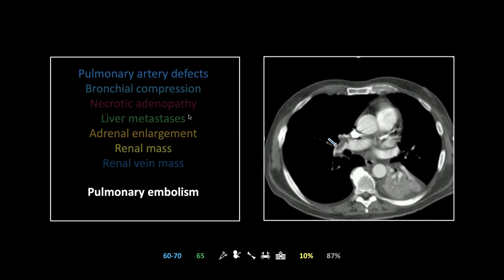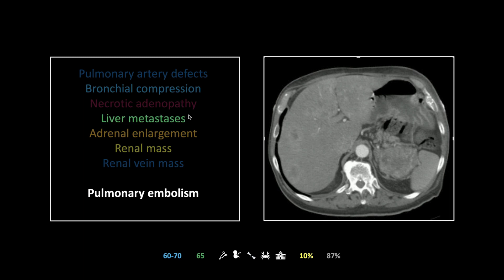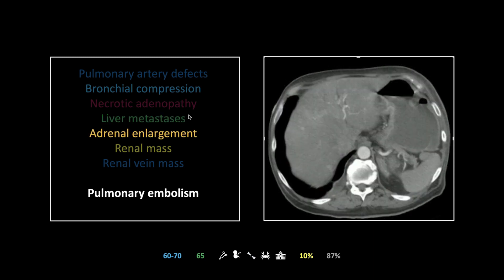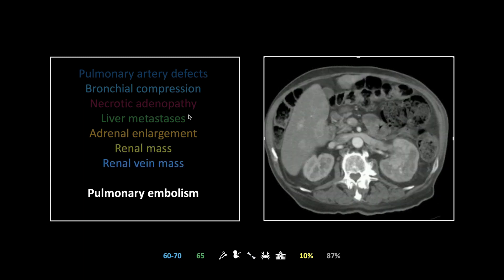Here is our pulmonary embolism case. There's the filling defect in the right pulmonary artery. At another level you can see bronchial compression — the left lower lobe bronchus is pinched just past its origin, and the culprits are two necrotic lymph nodes on either side. Under the diaphragm there are heterogeneous liver lesions. The left adrenal is significantly enlarged with a contiguous mass running from the left adrenal to the left kidney, and that enhancing mass is actually invading the left renal vein.